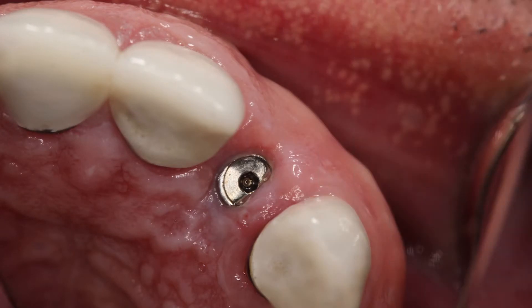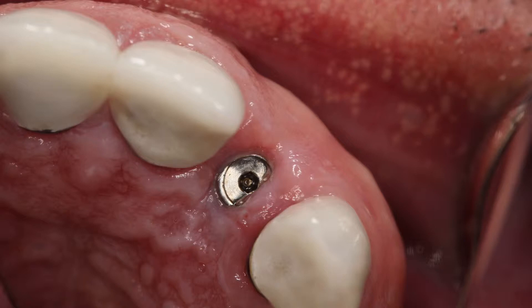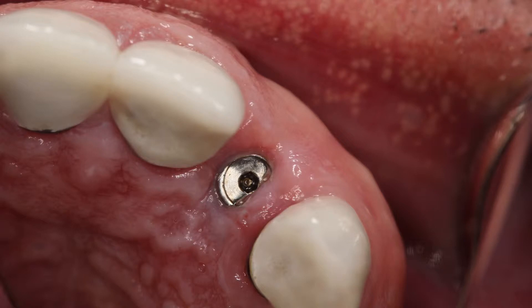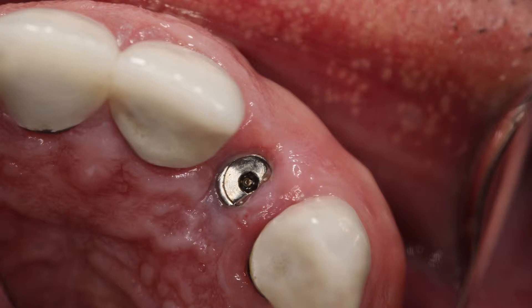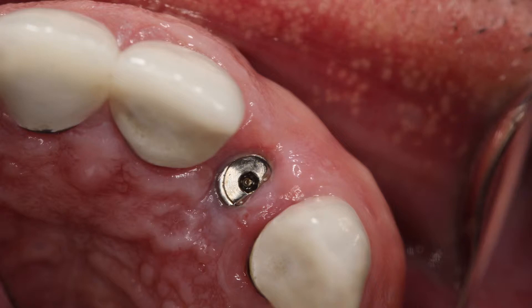In figure 2, we show that after integration of the implant for approximately 4 months, the soft tissue and papilla exhibited healthy regeneration. Note the physiologic position of the implant, which was placed approximately 3 millimeters palatal to the facial aspect of the adjacent crown. Maintaining that facial tissue over the implant will allow us to get a better emergence profile with our final crown.